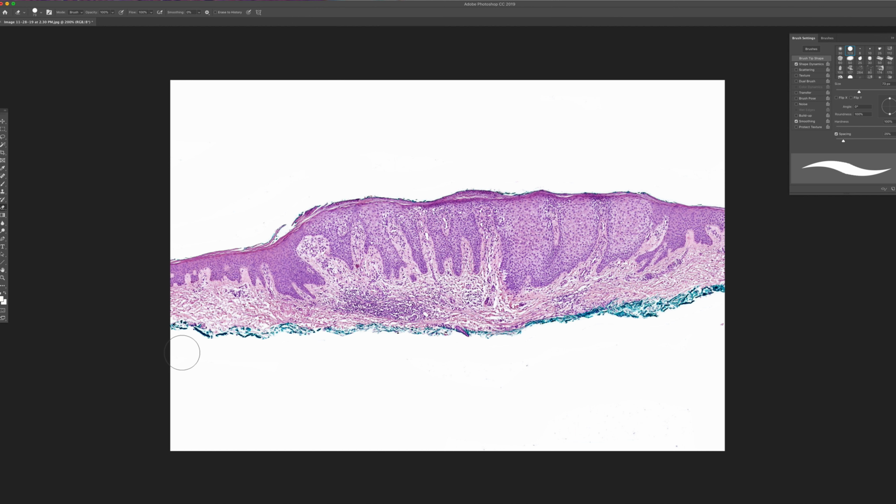So after you've done that, you sometimes have to go back, as I'm doing, with the eraser tool to get rid of the bits of dirt that have suddenly appeared. And you have to keep your eye out for that, because it can always be a problem. But anyway, that's it back again. Oh, there's another bit there, and a bit up there.